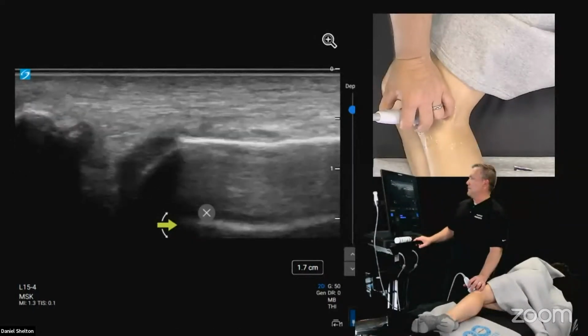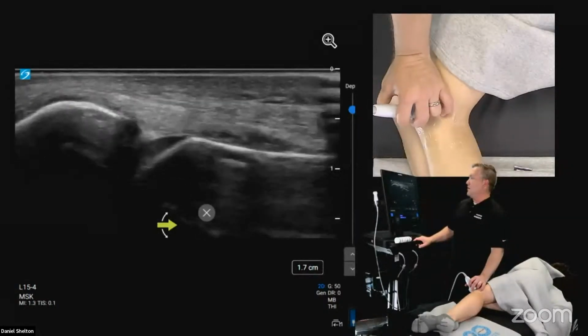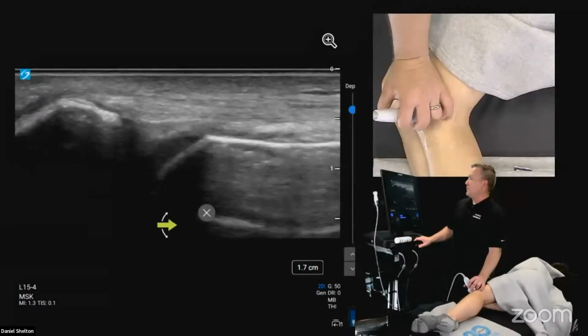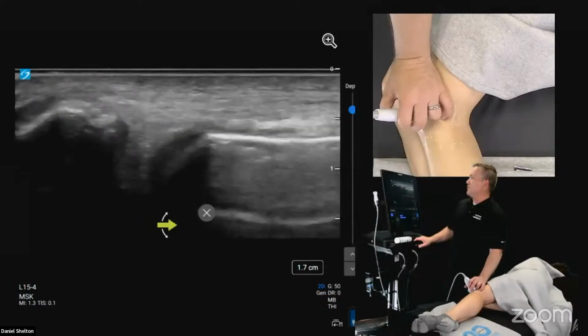And if it's synovitis dealing with a more systemic rheumatoid condition, you're going to look around for erosions. You're going to be looking at cartilage for calcium deposition. You're going to be looking at all kinds of other autoimmune potential that may just contribute to your diagnosis.